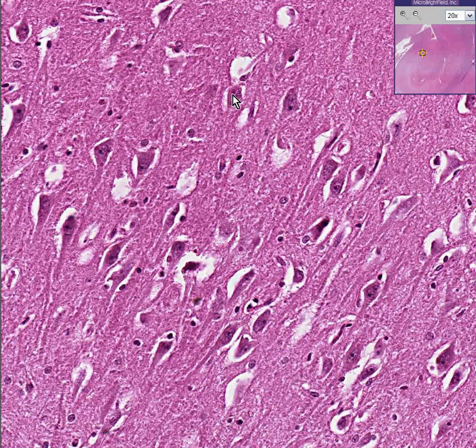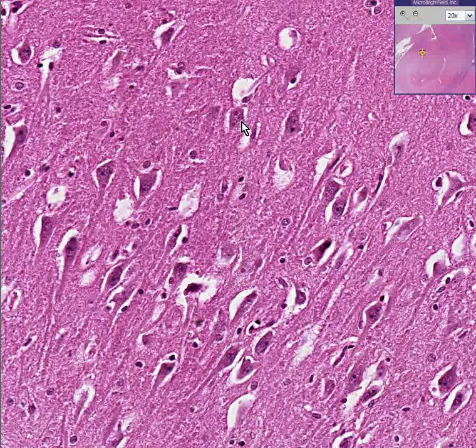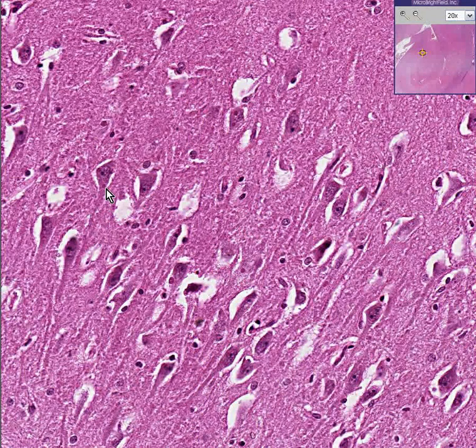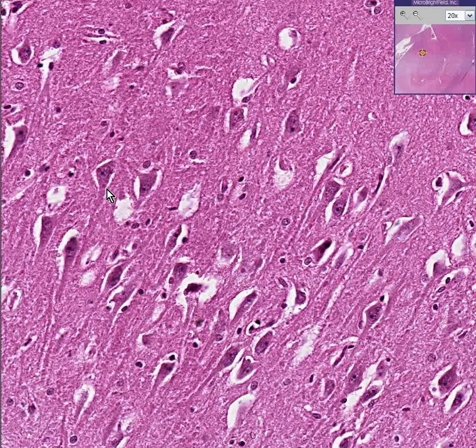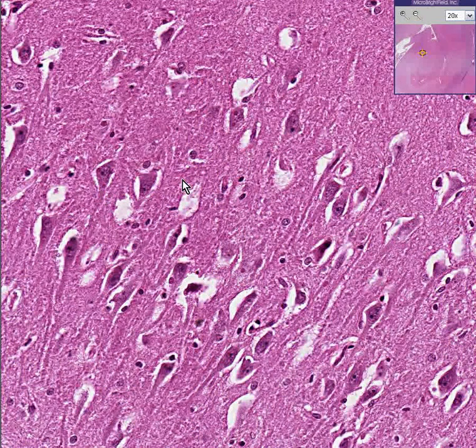Notice — this is as far as we could go — notice how in some of these cells, separate from the nucleus, you have these red granules. There's a really nice one as well. Negri bodies — N-E-G-R-I bodies — which are the viral inclusions inside the cytoplasm of involved neurons in people with rabies, is what these little red granules are. They're red, they can be multiple, they can be variable sizes, and they are not in the nucleus.